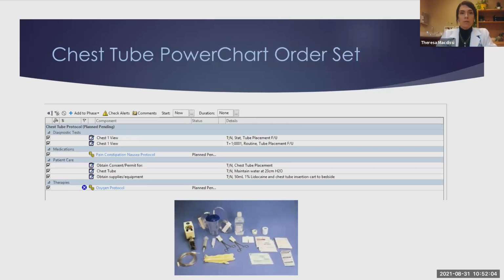So they wanted me to include kind of what the PowerChart order set looks like for when a chest tube gets ordered. So you can see that after a chest tube is placed, they're going to get a chest x-ray to ensure correct placement. And so say if it was placed for a pneumothorax, maybe we'll already see the lungs starting to come back up at that time of an x-ray.